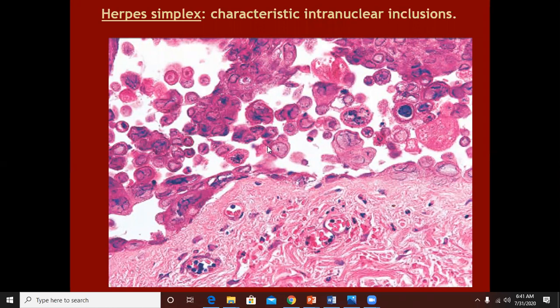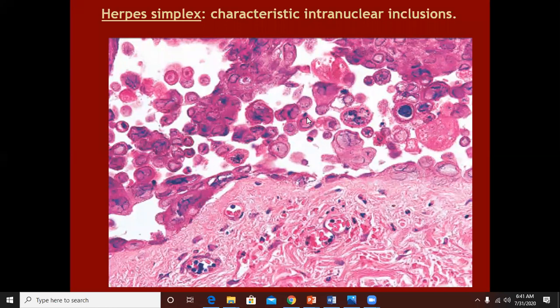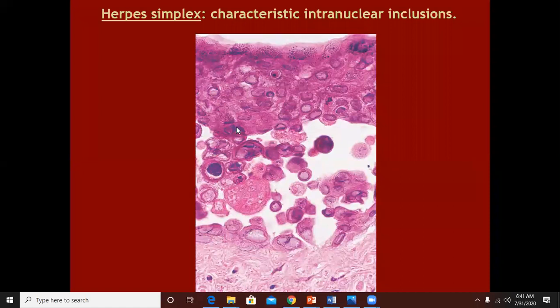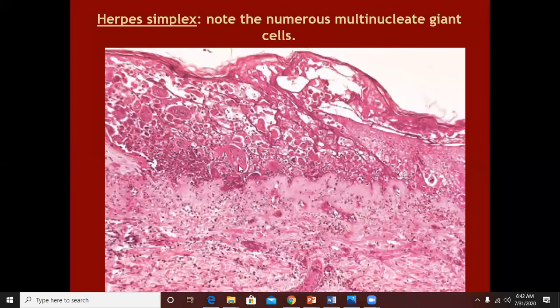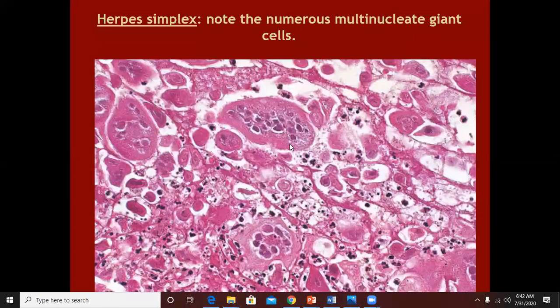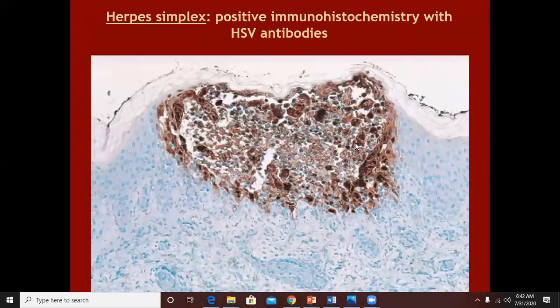The viral inclusions of viral warts were intranuclear as well as intracytoplasmic, but the viral inclusions of herpes are intranuclear inclusions only. These inclusions are present mainly in the keratinocyte. They can be of different shapes. These kinds of inclusions are not seen in pemphigus. So the distinguishing features are: giant cells, balloon cells, acantholytic cells, and cells containing viral inclusions. This is a typical appearance of herpes simplex.